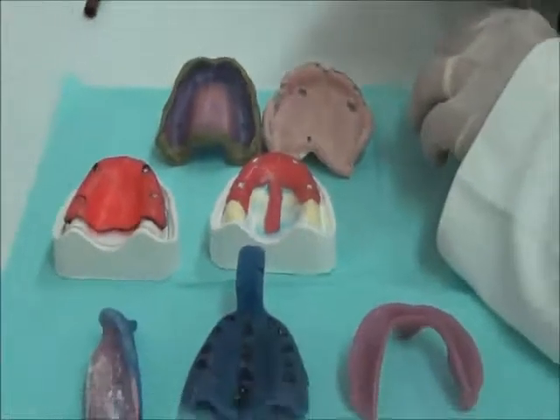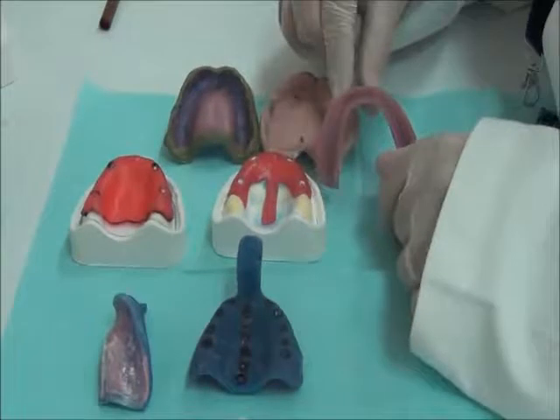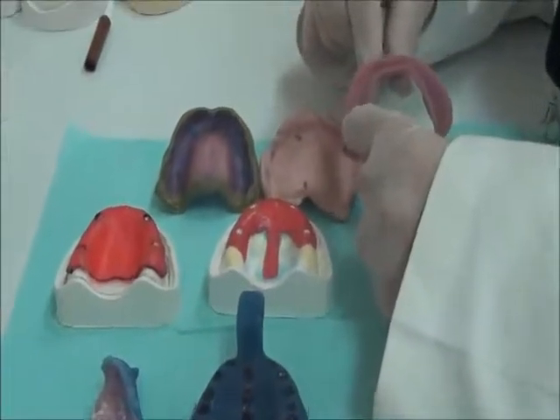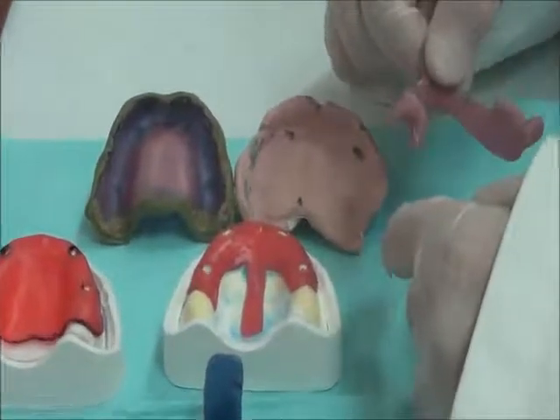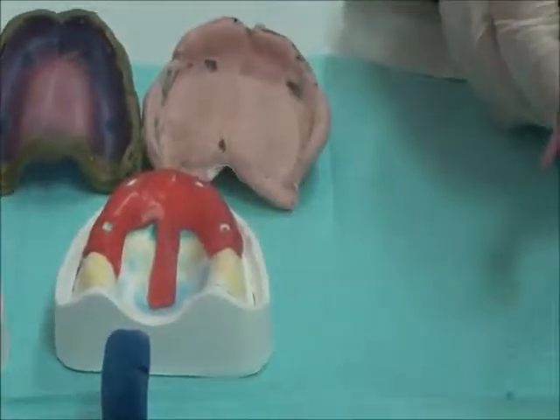So the cases that don't have any spacer, we will put the zinc oxide eugenol, and this zinc oxide eugenol will be pressed between the tray and the tissue beneath firmly. That means all of the tissue are displaced.